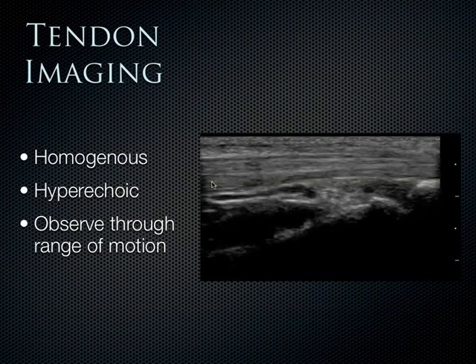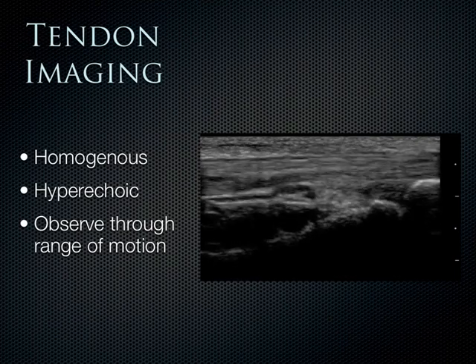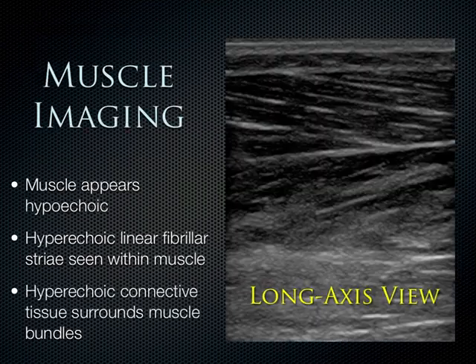And here's a tendon taken through its range of motion. As the joint is ranged, we can see this tendon demonstrate a homogeneous and quite hyperechoic appearance as it slides along its tissue plane.